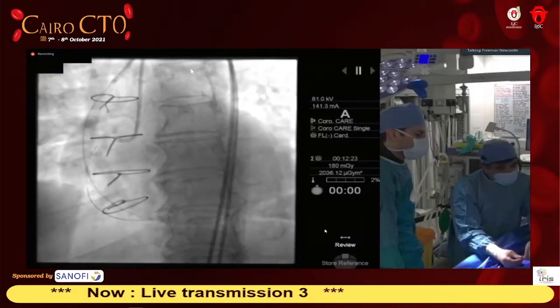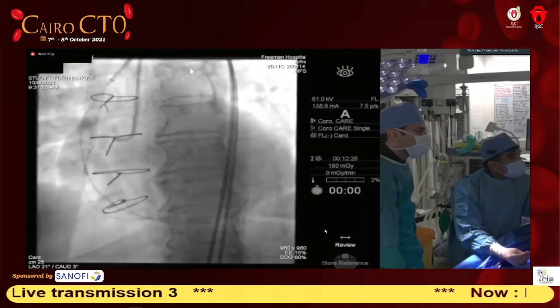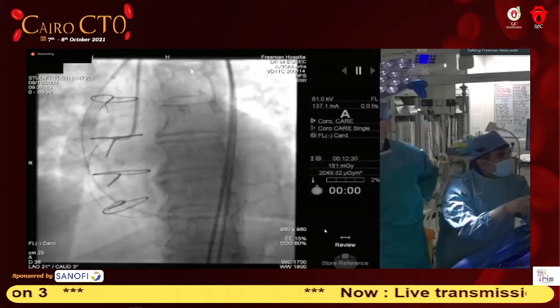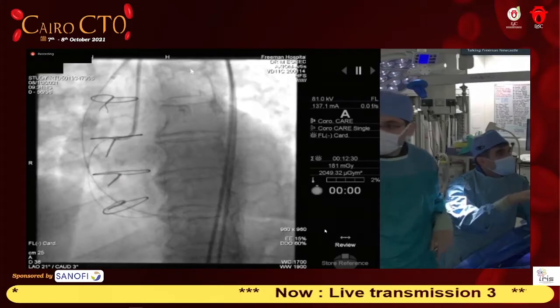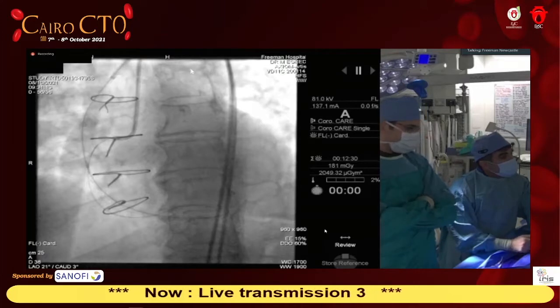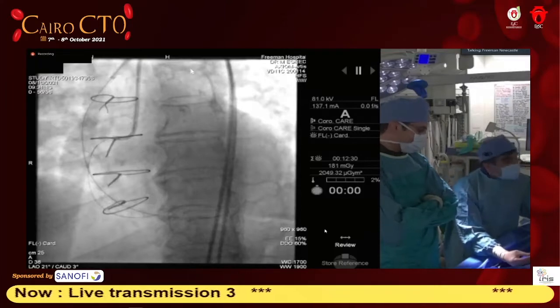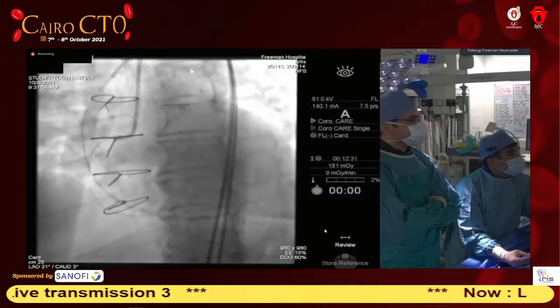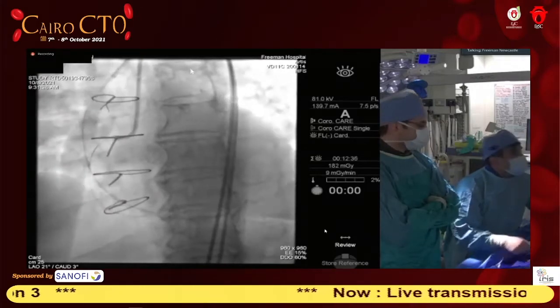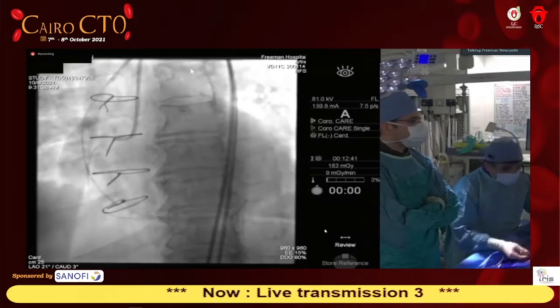I'm going to try to. So one option, once we've got to the antegrade catheter, which here hopefully will. Okay, so you could do this, get it to the antegrade catheter, advance your microcatheter, and then take an externalization wire, which is the RG3. It's 330 centimeter. But I'm going to try to see if you could do a tip in. And the tip in technique here means that you take the antegrade catheter and you try to get the wire into it. And what you want to do is put the catheter or the microcatheter on the bend, because intuitively and physically the wire will choose the bend.